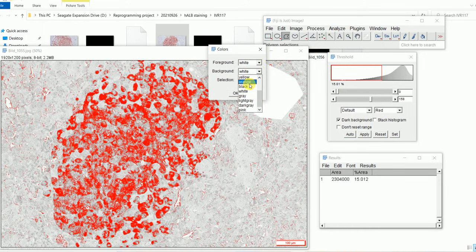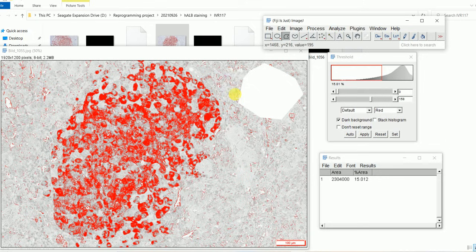Okay, this is really important. Otherwise, if it appears black, then that will also be stained red while doing quantification. Then you will click on OK while setting up. Okay, this is what I'm talking about, the settings.